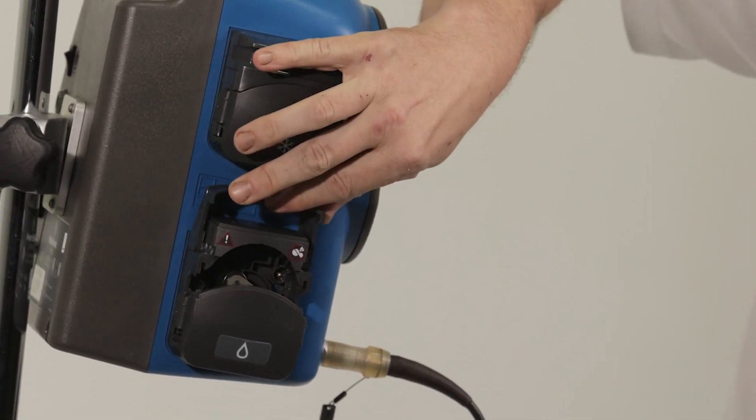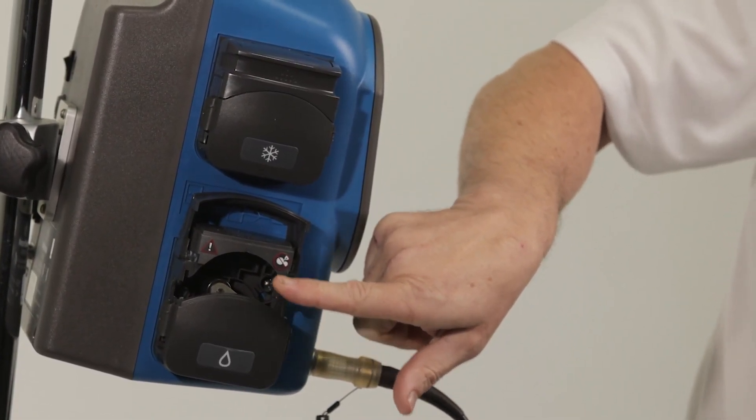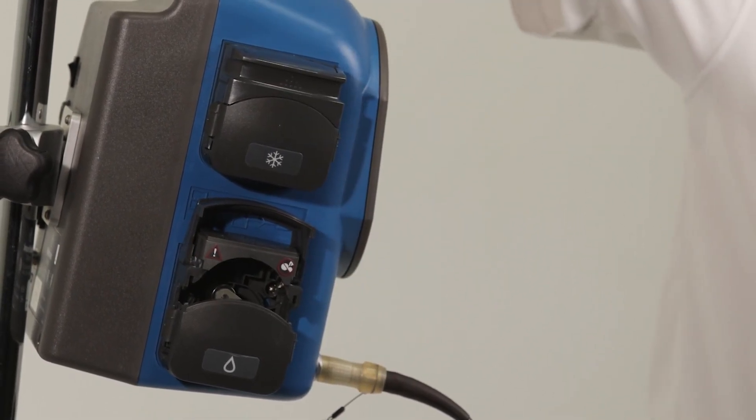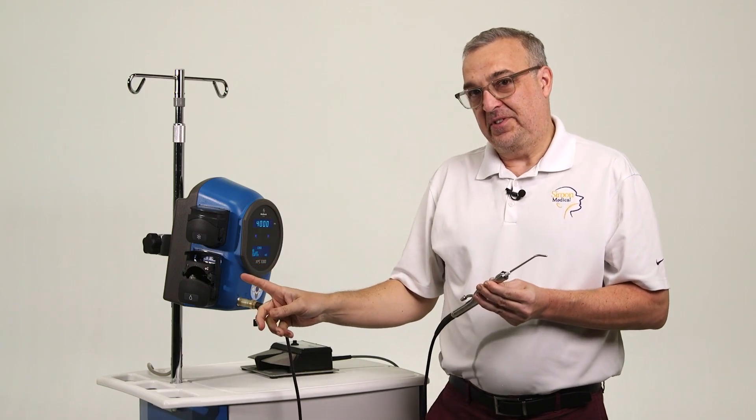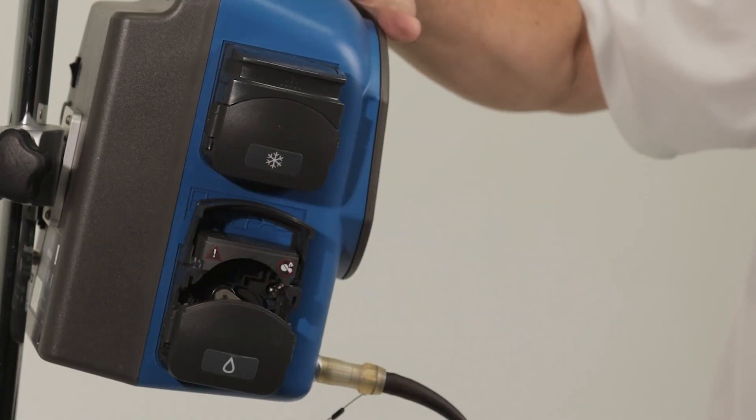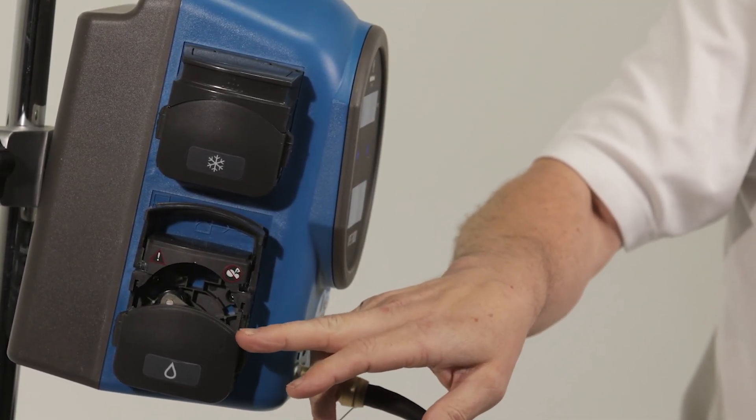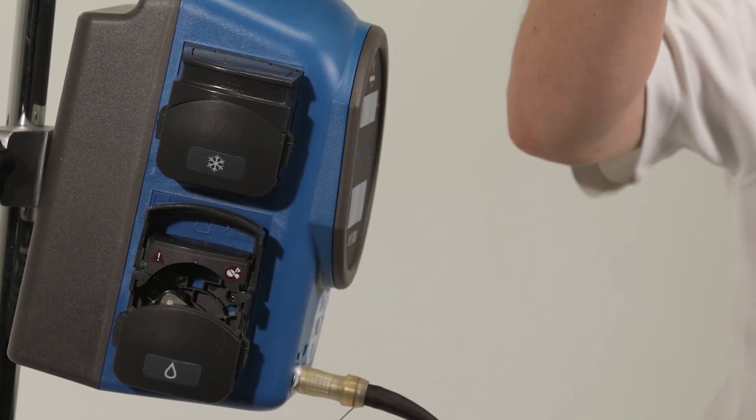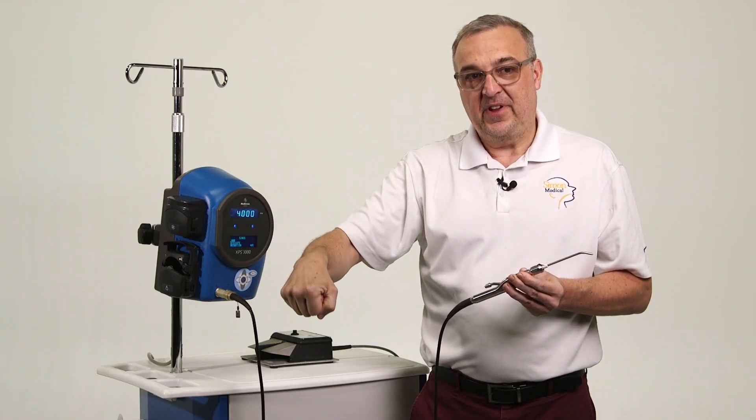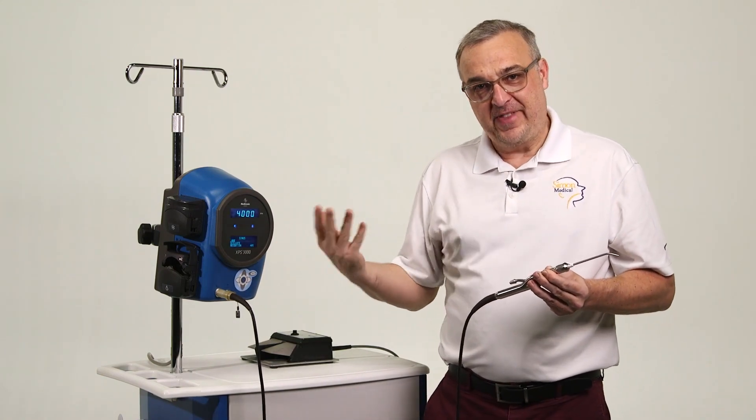You open this up. Irrigation tubing will slide in this opening and into our saline bag up here. One caveat I would say, when you put the irrigation tubing through here, you need to make sure it's centered. If it's off center, there are some tight lips here and it can get stuck in those tight lips and then you won't have irrigation. So just be cognizant of that.